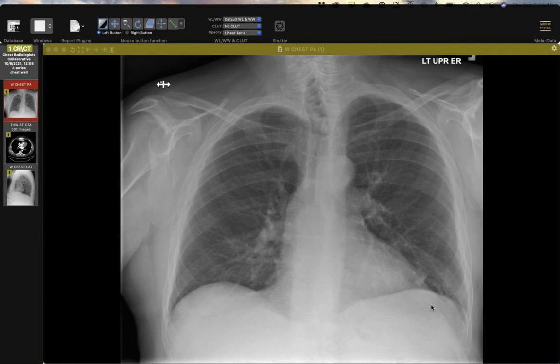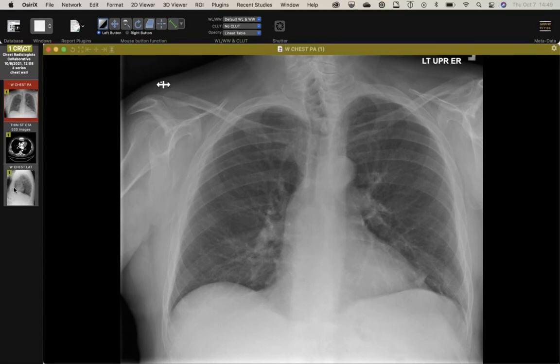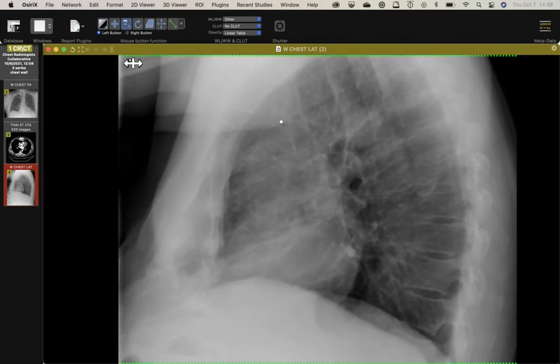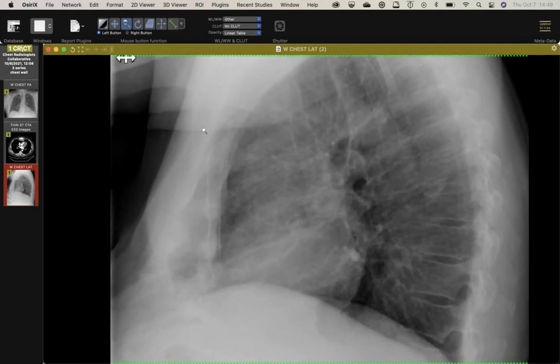And I did a little looking into it earlier. So this guy presented with some chest pain, and his frontal radiograph doesn't look terribly exciting. And this is his lateral, and I'll just point out you can see he's got a pectus deformity there. And then there's sort of this dense tissue, but at the time really not noticed and probably not important. So nothing acute going on.